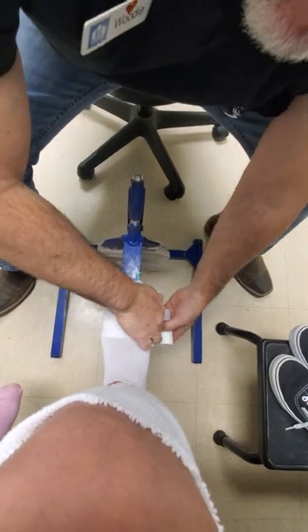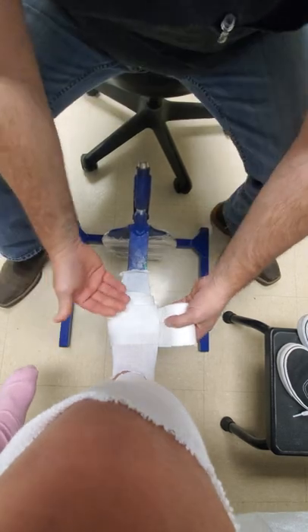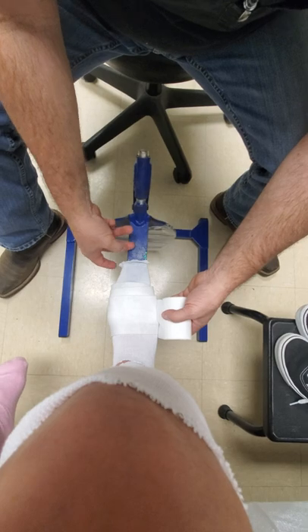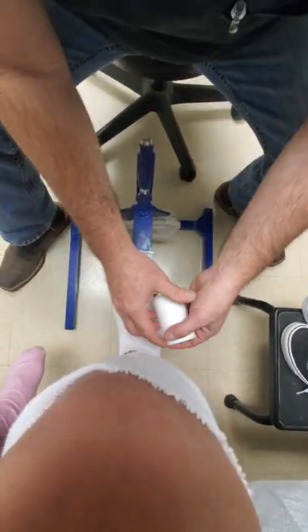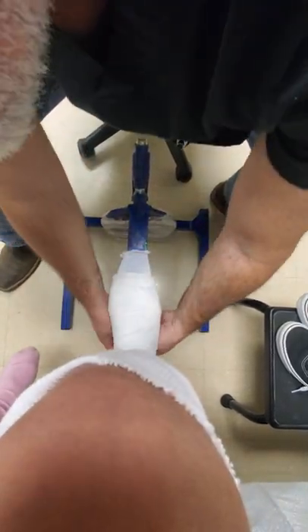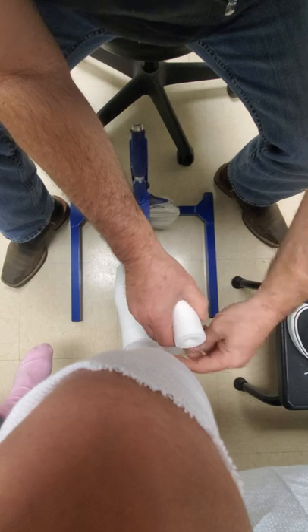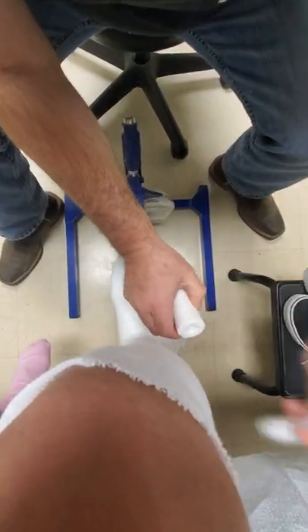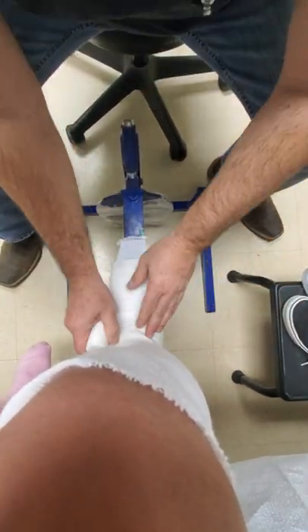The padding you've seen me do multiple times is your standard web roll padding. You're wrapping the padding around the stockinette, around the foot, and in this case around the cast stand as well. Basic ortho 101: the sock, the padding, the fiberglass — none of it goes on tight, it goes on very comfortably. As you get to the crease or angle, you can either do the shear method, which you see me doing here, or you can cut it into strips, which I'll show in just a sec.